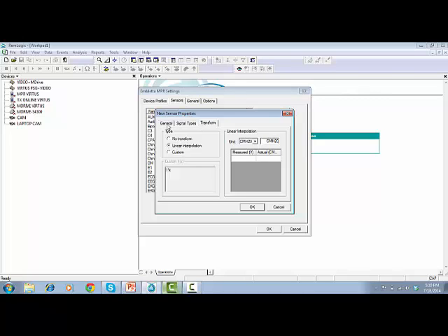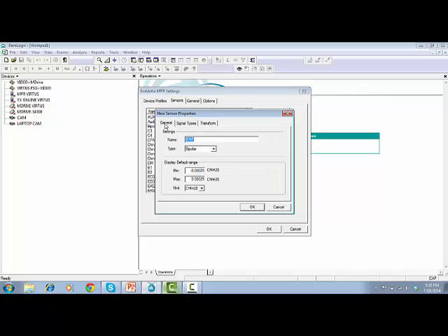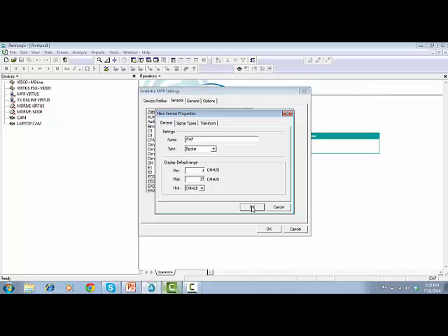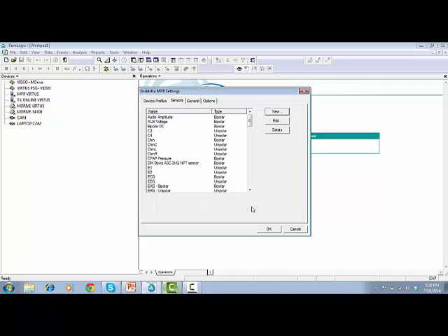Go back to General and change the Display Default Range. Type 4 for the minimum range and type 25 for the maximum range, and click OK.